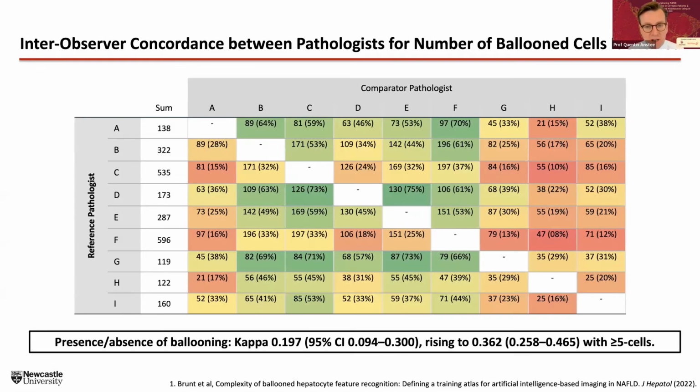But when we started to look at specifics of which cells the pathologists were actually identifying, and to look pairwise to see what degree of concordance there was, what we found was that between individual pairs of pathologists, the degree of inter-observer agreement varied anywhere from just 8% overlap in terms of identifying the same cells up to 75%. And so, as you can see here on the heat map, there were certainly substantial areas where individual pathologists were not identifying the same cells.